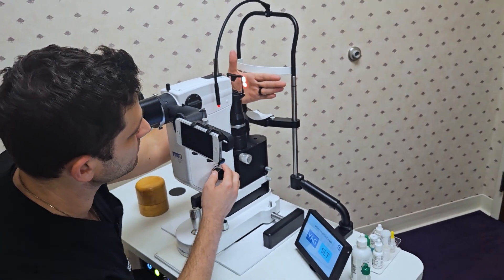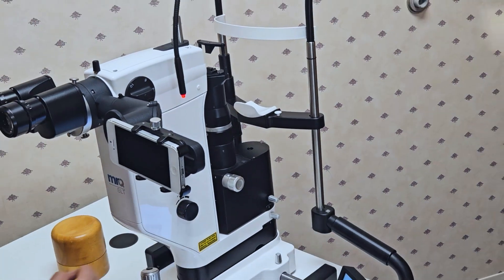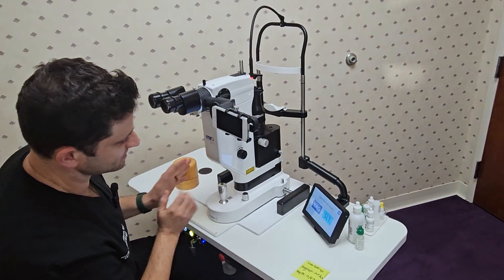Now in terms of the aiming beam — kind of hard to see here — but going up or down will adjust the brightness of the SLT beam. Other than that, we'll just revisit the SLT lamp in just a moment.